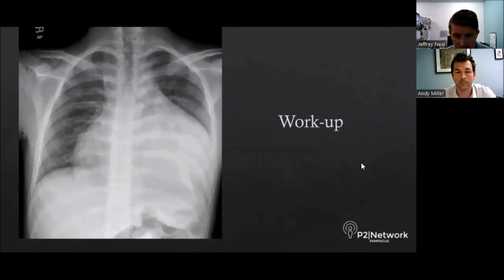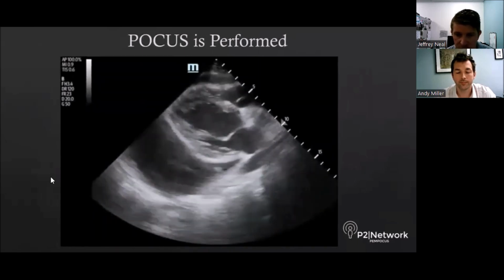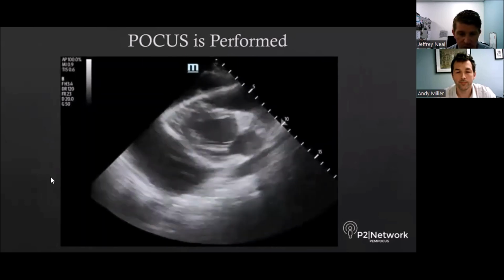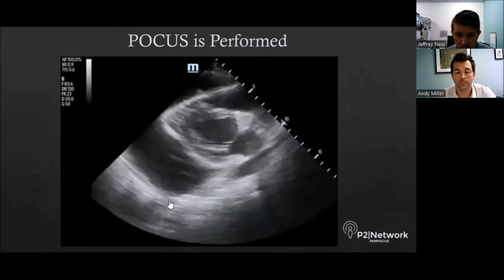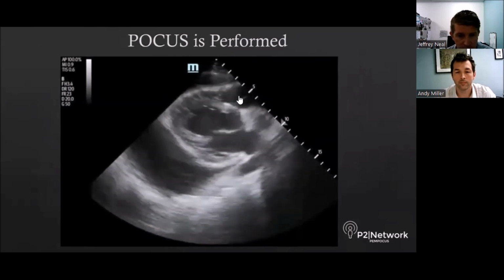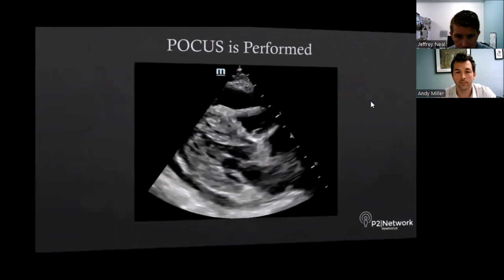A chest radiograph was taken, which demonstrated a significantly enlarged cardiac silhouette, as you can see here. So then we proceeded quickly by putting a probe on the patient. As you can see in the parasternal view, there's a massive effusion with loculations. Focusing on the right ventricular free wall, you can see evidence of diastolic collapse as the wall collapses down when the mitral valve is open, which is during diastole. This is sometimes referred to as appearing like a man jumping on a trampoline.